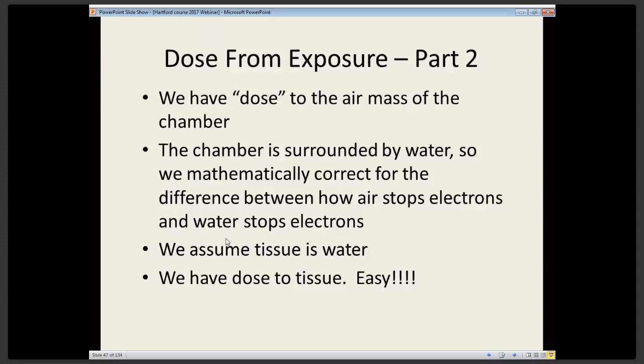And you're probably asking, well, how do we correct for that few percent? And the answer is very easy. Because every patient gets a CAT scan as part of their treatment planning, the CAT scan has Hounsfield units. The Hounsfield units relate to tissue density. The treatment planning computer can very easily correct for the tissue density of fat, water, muscle, gland, bone, etc. So those few percent are corrected for in the treatment planning system using the Hounsfield units from the CT simulation.